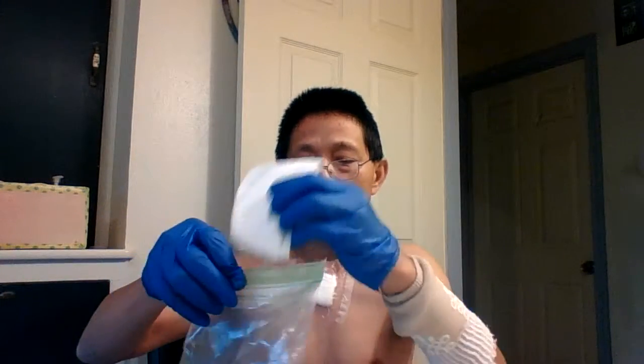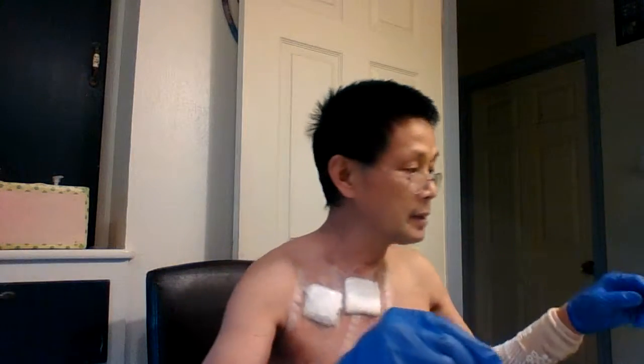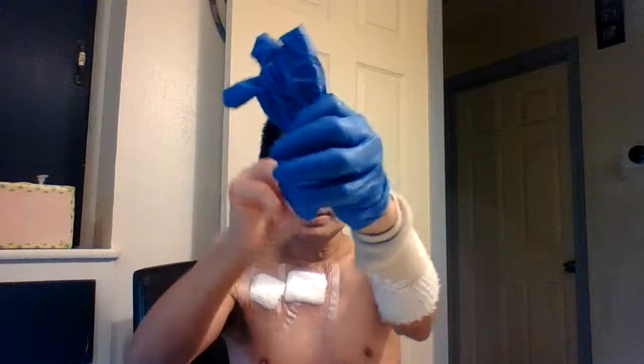And yeah, put it back in the plastic bag to keep the scissors sanitized. Now the last thing to do is just clean the tabletop. Take all the tabletop trash, put it in the trash can, and remove the gloves.